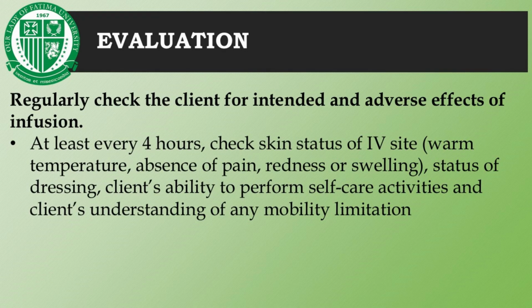While doing that, you should check the skin status of the IV site: if there is warmth of the temperature, an absence of pain, redness, or swelling. Also, check for the status of the dressing, the client's ability to perform self-care activities, and the client's understanding of any mobility limitation.